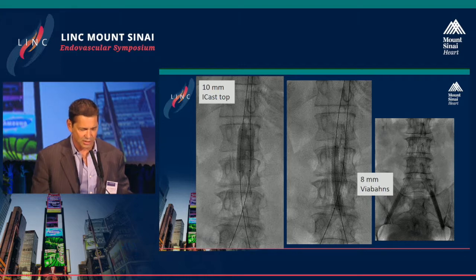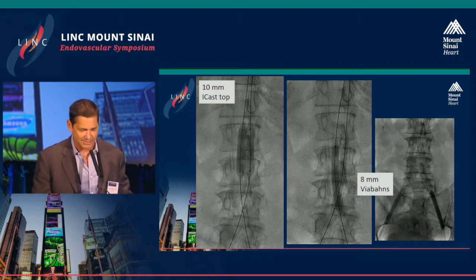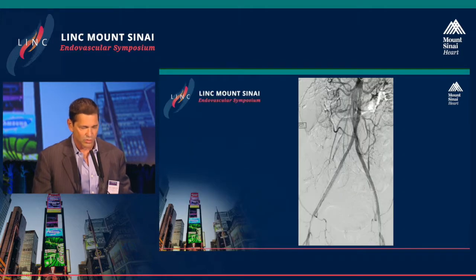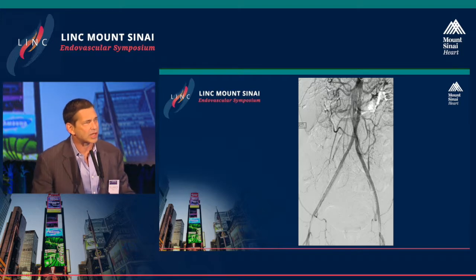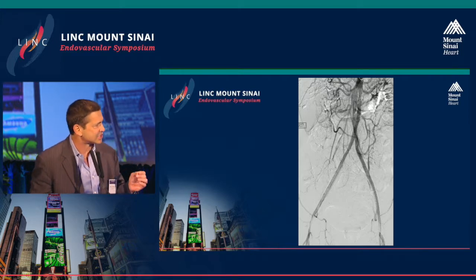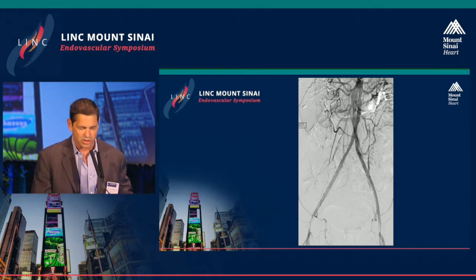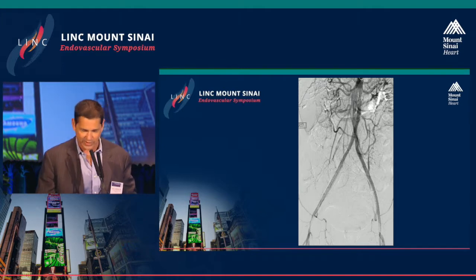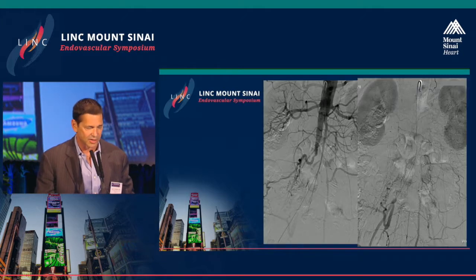Then we complete this reconstruction out through the iliac segments, staying above the hypogastric arteries with Viabahn stent grafts, which is then post-dilated throughout with a very nice result. Part of the trick here is — you might ask why don't we go larger — but again, with a densely calcified aorta, understanding the luminal limitations and wanting to avoid rupture, which would be a catastrophic endpoint when treating this calcified vessel.